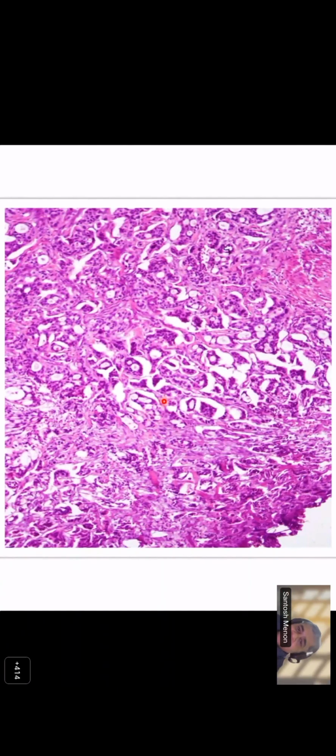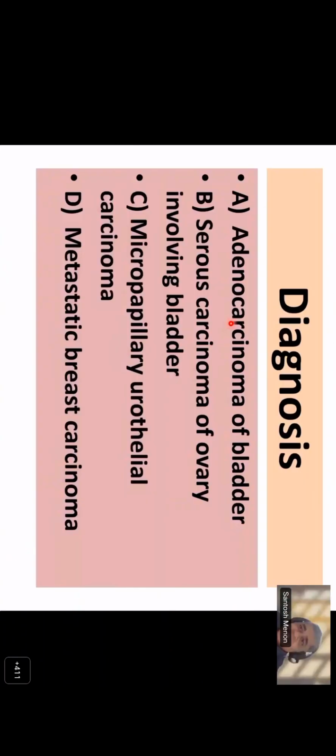So sometimes these micropapillae can have this kind of morphology in which they have a luminal kind of appearance, and they're called ring forms. So they look like rings. So this is what you call ring forms, which can occur. You can very well say that these retraction artifacts are within the lamina propria. So it's a lamina propria invasive tumor, which is very clearly seen. So what do you think the diagnosis is? I think you know what the diagnosis is: micropapillary.